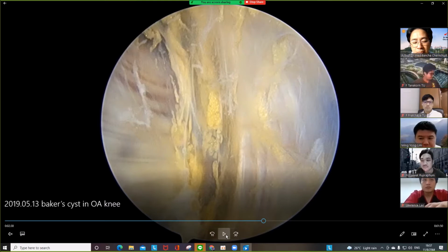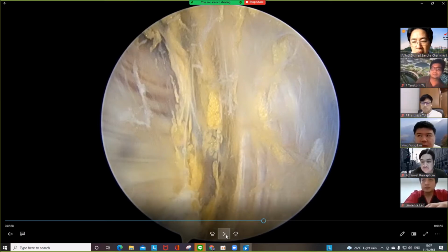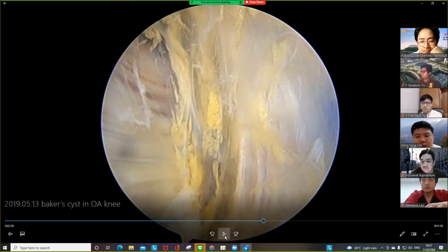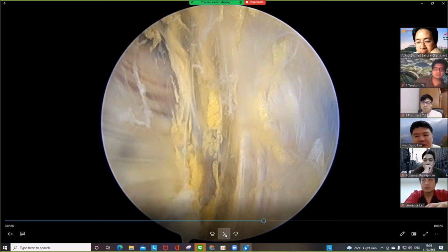I have a question. I don't get it when we are in the posteromedial corner. What is the point? I mean, where do we go to the valve? Because what we are seeing is only a capsule reflection, right? From the posteromedial corner.